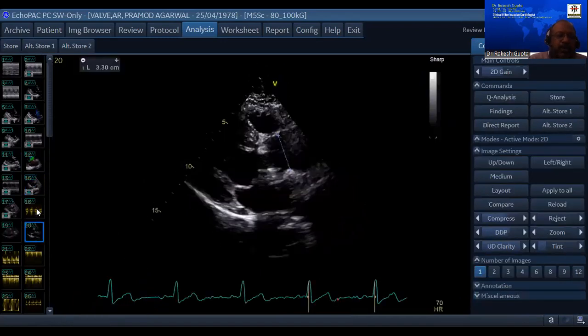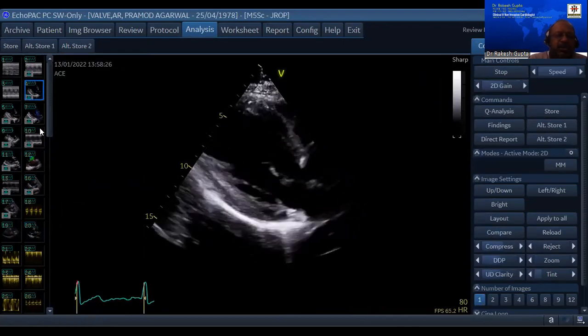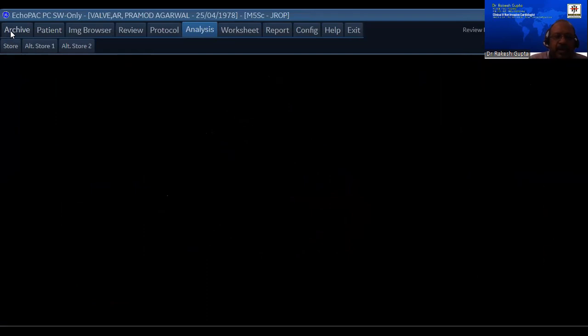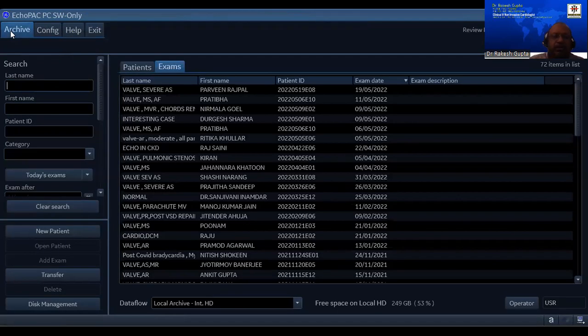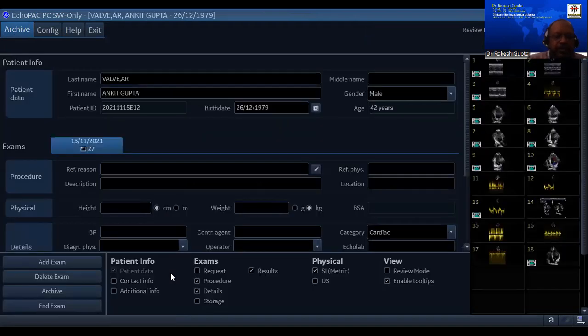Again, the most common parts of aortic regurgitation, as we told you, are jet width, jet height over LVOT height, vena contracta, and holodiastolic reversal of flow in the descending aorta. Sir. So let me show you one by one.